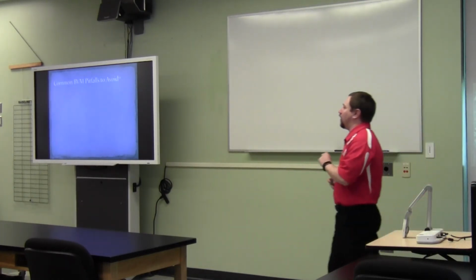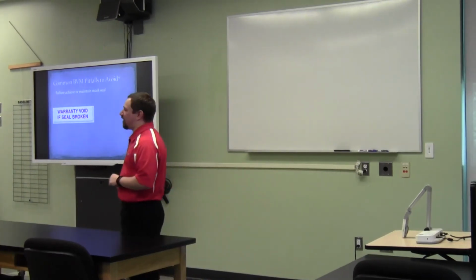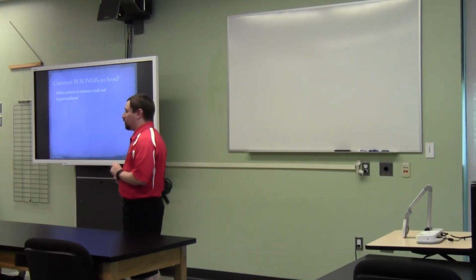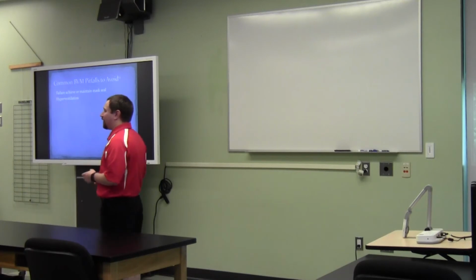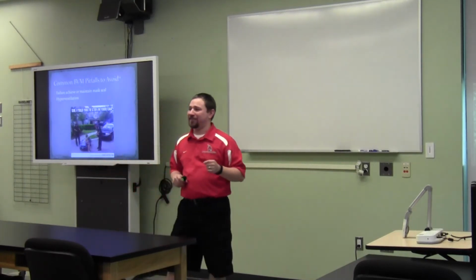So here are some common pitfalls of bag valve masks we have to avoid. First things first, we have to maintain an appropriate seal. Otherwise we don't get what we're looking for. We don't get the concentrations, we don't get the pressures. We also get a little excited. We start bagging like we're going to pump these people back to life, like it's a blood pressure thing. No, I can't. Because guess what? Speed is bad.